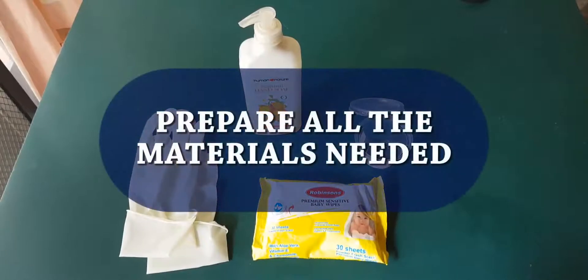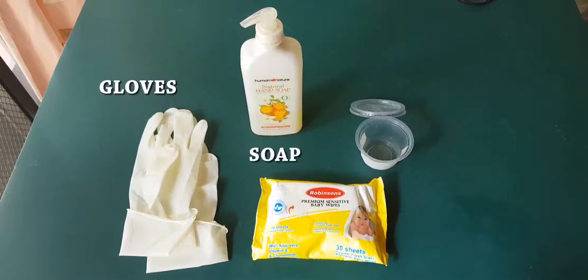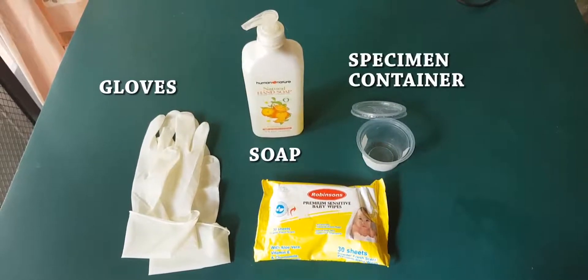First, you have to prepare all the materials needed: gloves, soap, specimen container, and wipes.